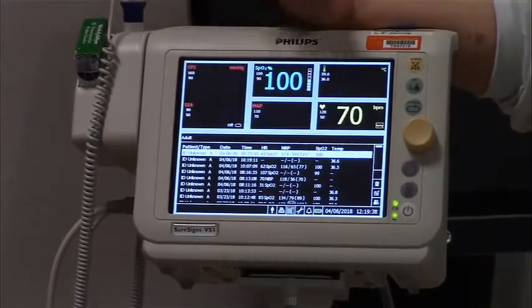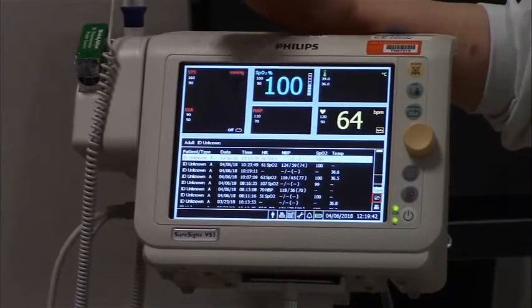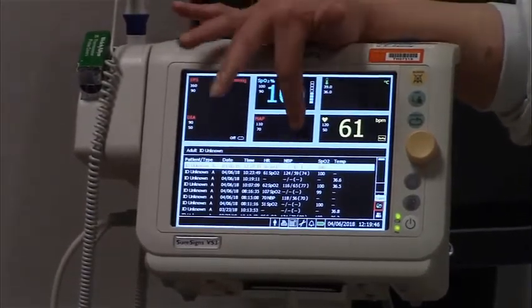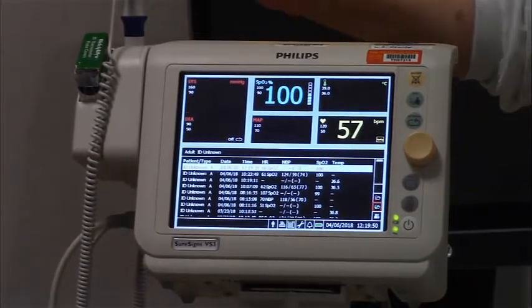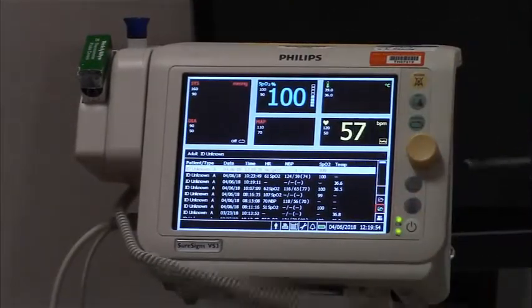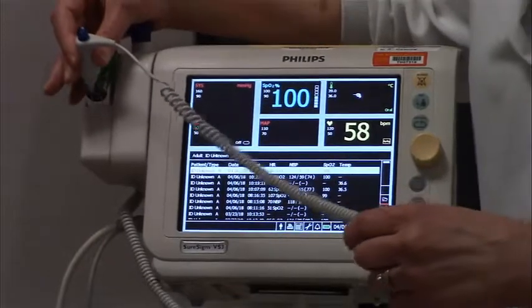And in between, where it switches from systolic to diastolic, you often hear it referred to as the MAP or mean, and that also records here. Some units will need to have you record that, others will not. So I'm just going to run through a set of vitals to show you how this machine works. There is a cover to go over your temperature probe.